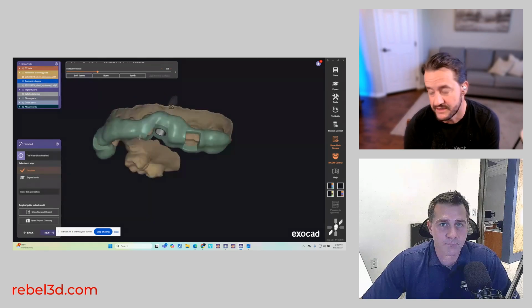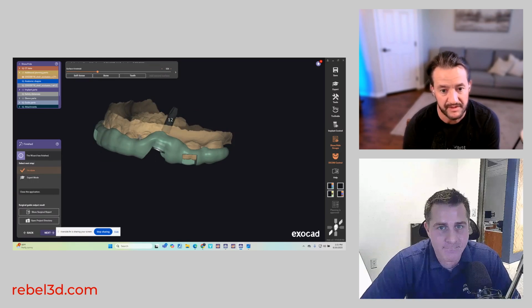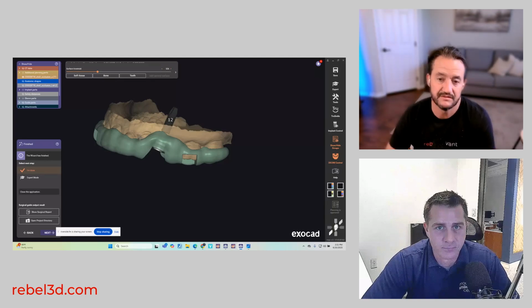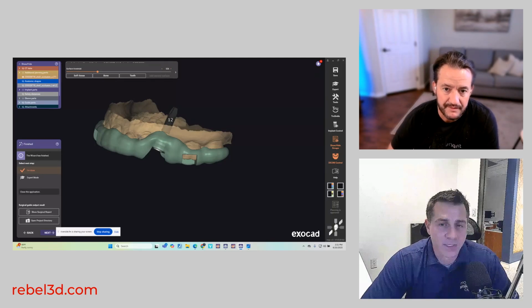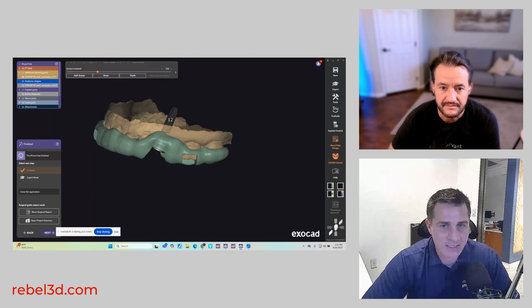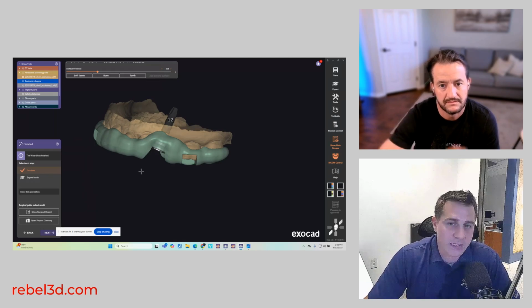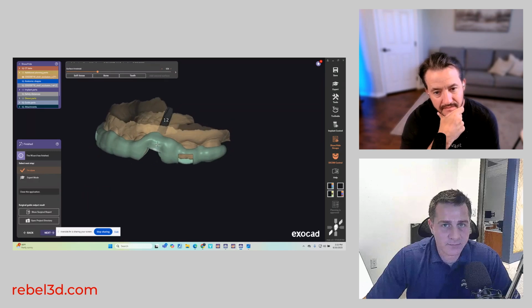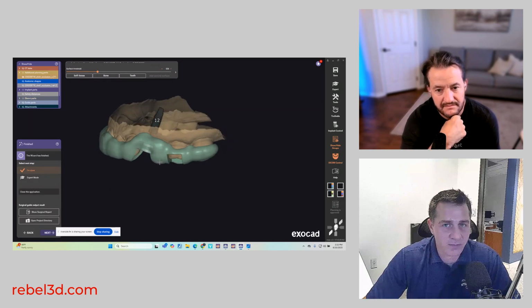And then what is this saving you? Like, your surgical appointment, is it saving you time or just giving you confidence in your flow using this process? Yeah, the confidence for placing that implant exactly where I want to put it, not only for restorative purposes but anatomically, and knowing that I'm putting it right where I want around some vital structures like a canal or something like that. That confidence makes everything so much smoother at the time of placing the implant.